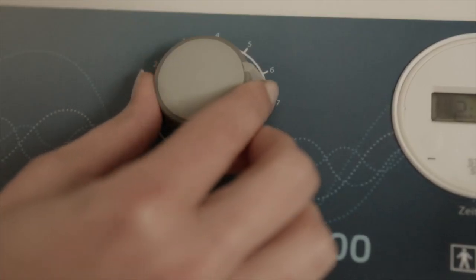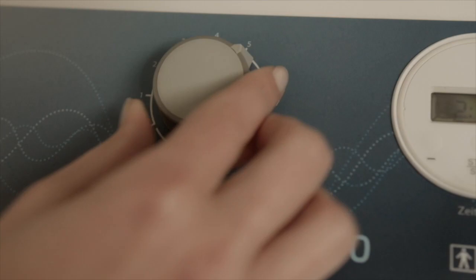As the acidity in the tissue decreases, again, a lot does not necessarily help a lot, and less is sometimes more. The treatment should always be pleasant. It is also not the goal to at some point reach the uppermost intensity levels. Such a high intensity is not necessary, because even in the lower intensity range, pneumatic pulsation massage is extremely effective and relaxing. Depending on the severity of the cellulite, you can also massage with a double tube and 2 cups, so you can save time.